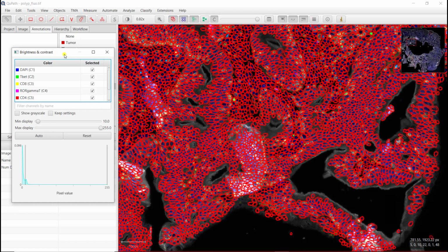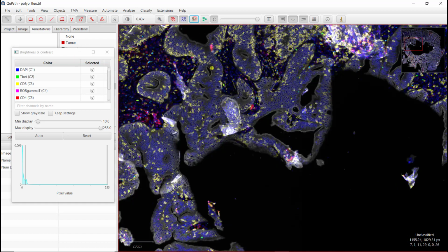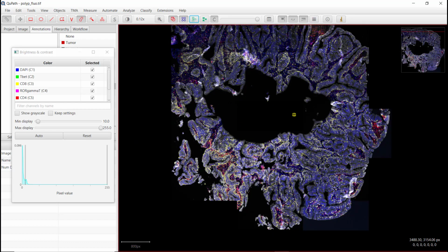And that should help, especially as fluorescence is not the same across the image, and here clearly it's not the same across the image. So if you just do a threshold, if you have one region that is brighter than another, you might get positive cells in the brighter region that shouldn't be positive, or the other way around, just positive cells in the bright region, and in the other regions you can't get anything.